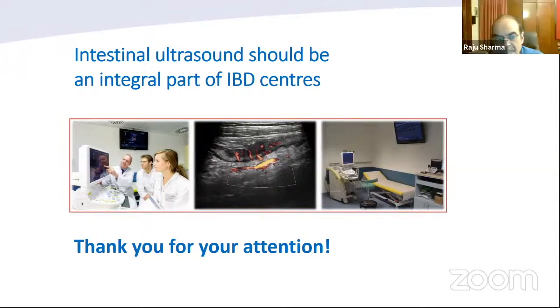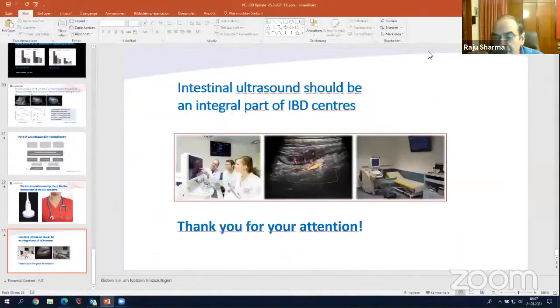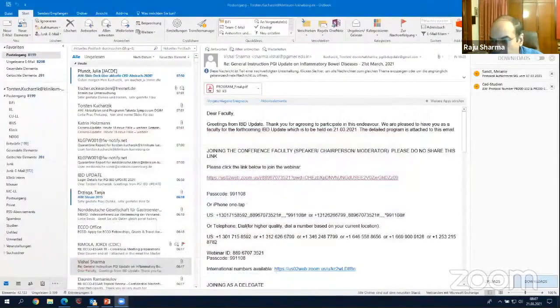Thank you very much, Dr. Kucharzik. We do have a few questions for both of you. And let me just set the ball rolling by asking you that one of the criticisms for ultrasound has been that it does not provide a comprehensive roadmap of the entire gut like MR enterography or CT enterography does. And evaluation of the jejunum and the proximal ileum is very difficult. How do you respond to that?